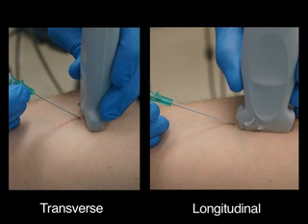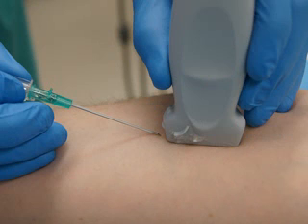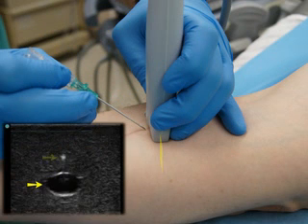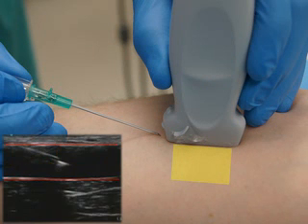There are two commonly used techniques for ultrasound-guided vascular access, the transverse technique and the longitudinal or in-plane technique. Transverse or longitudinal describes the orientation of the ultrasound plane with respect to the vein and the needle. In the transverse technique, the ultrasound plane is transverse to the vein and the needle, so the vein is circular and the needle is a single bright dot. With the longitudinal technique, the long axis of the vein and needle are in line with the ultrasound plane, so the vein appears as a tubular structure and the entire needle is visualized.